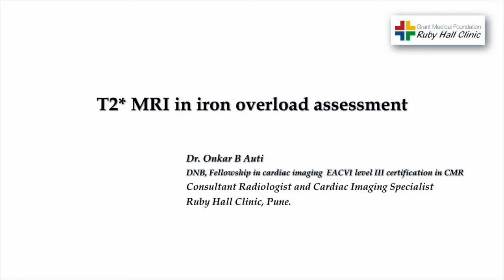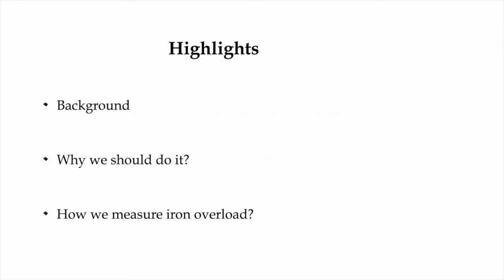Hello everyone, this is Dr. Onkar Auti and I am going to discuss the role of T2 star MRI in iron overload assessment. What we are going to see in this talk is the background of hemoglobinopathies and thalassemia, why we should do T2 star MRI or any iron overload assessment in these patients, and how we actually measure the iron overload in a particular tissue using MRI technique.